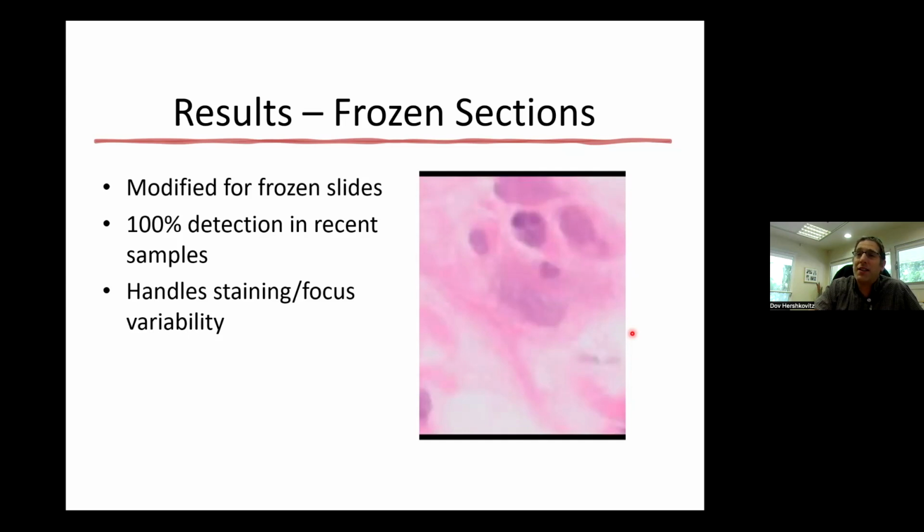And you mentioned in the presentation the challenges during surgery, and sometimes the pathologist requires multiple samples, and it could be related to the adequacy of the samples, but it's a big challenge also on the pathologist side, even if the sample is adequate, and the ability to analyze quickly multiple scans of the slides.